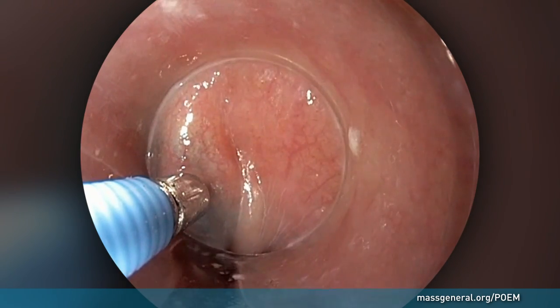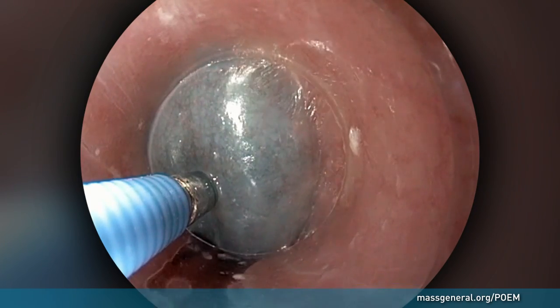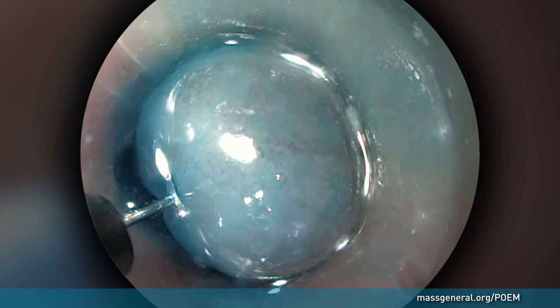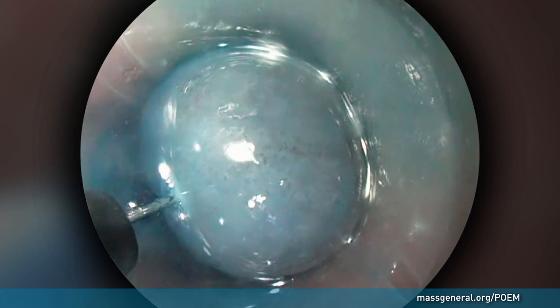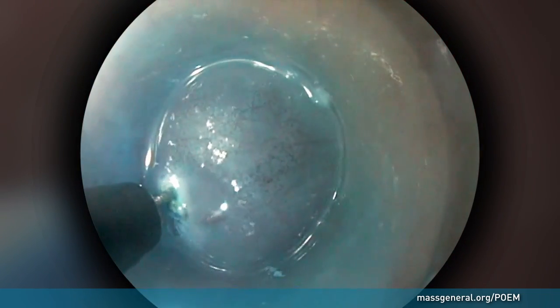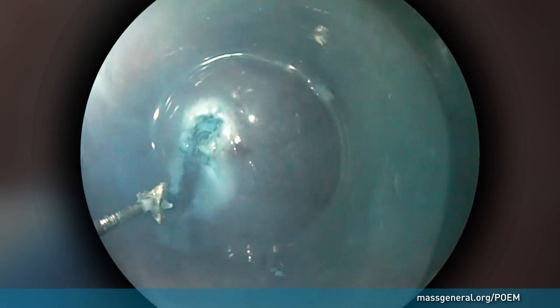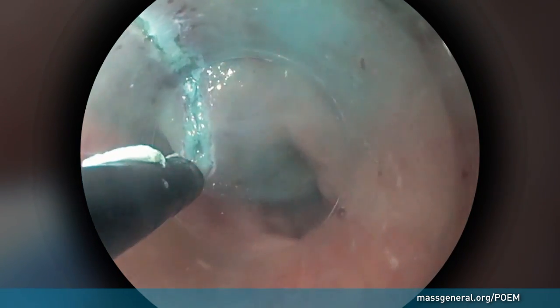This allows the surgeon to perform a delicate incision that only goes through that mucosal layer. Using a specially designed endoscopic tool, the surgeon makes a two-centimeter incision in the mucosal lining. The incision serves as the entry point to create the submucosal tunnel between the lining and the muscular wall of the esophagus.